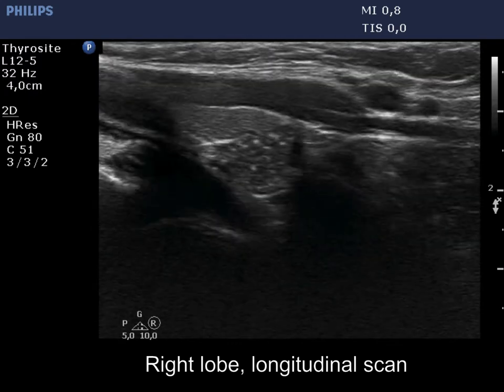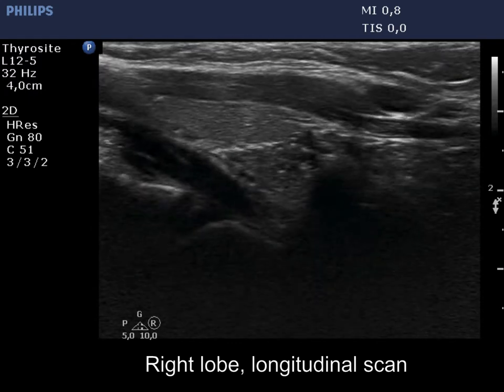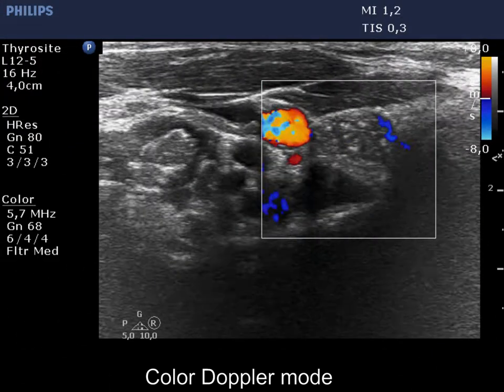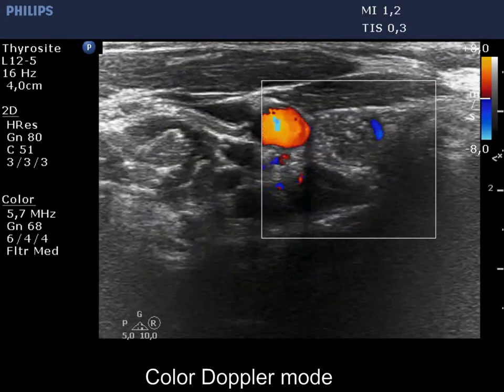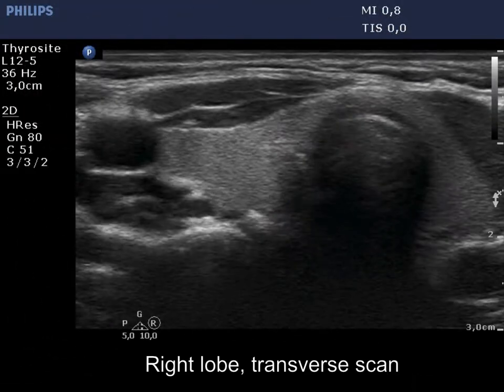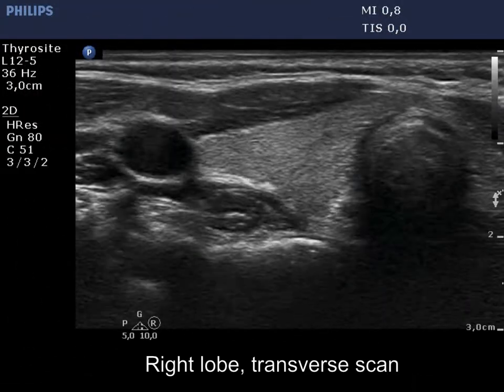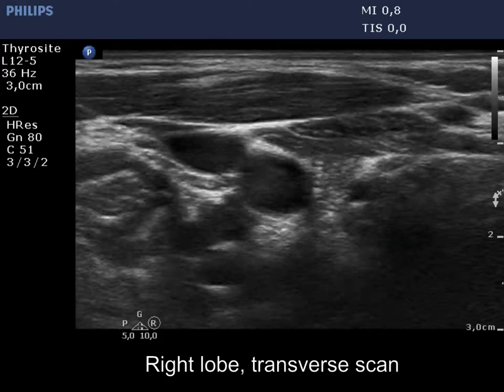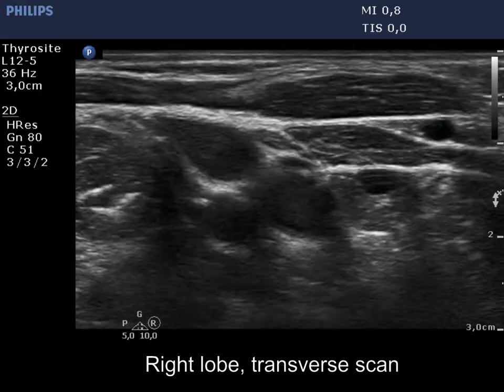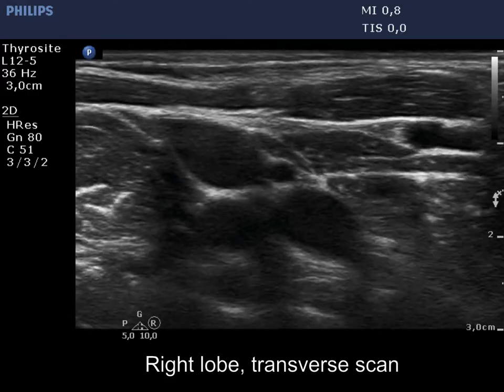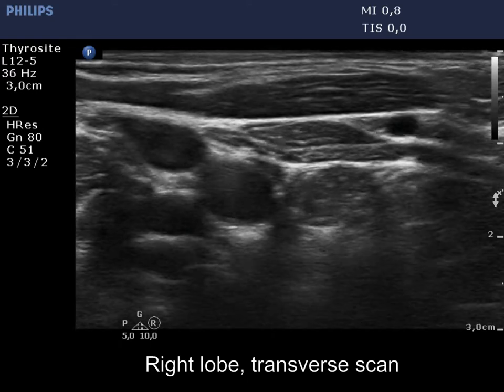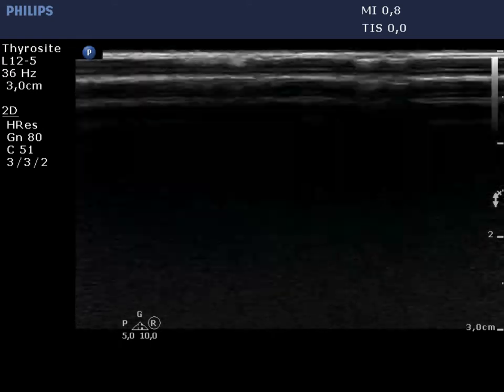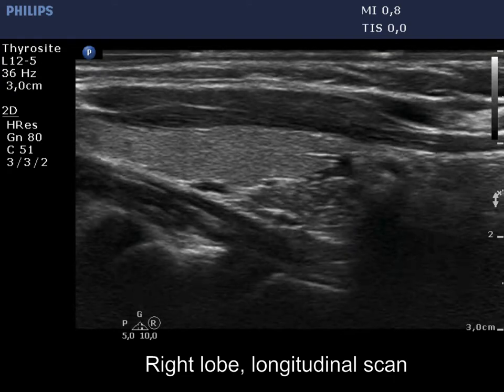The most striking feature is the presence of numerous hyperechoic spots. Vascularity can be detected at the edges of the lesion. Note the cystic area. The overwhelming majority of the echogenic figures are granules; only a few lines can be found.